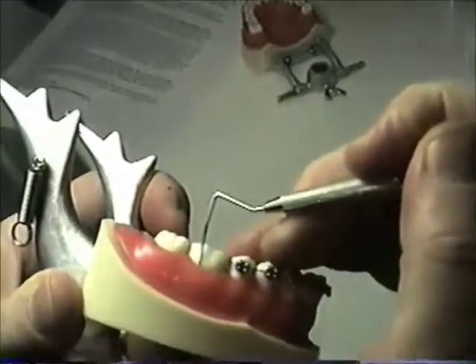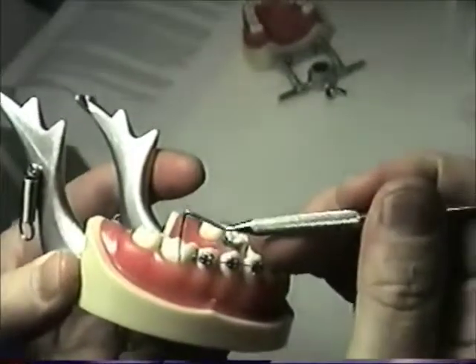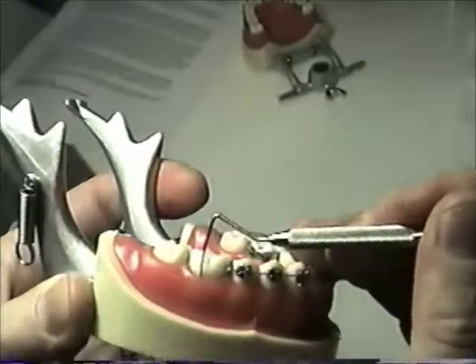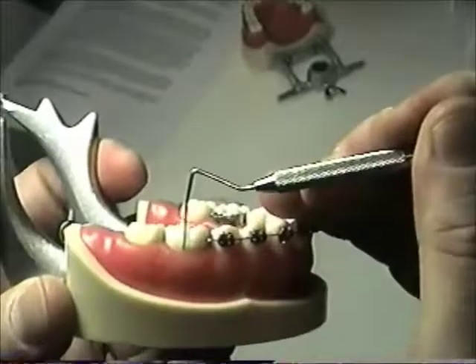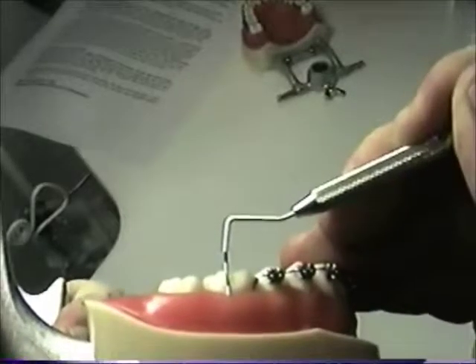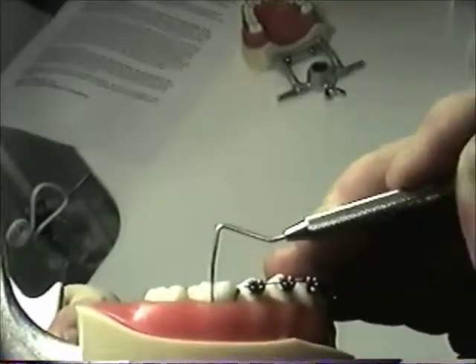Let me show you something. All around your teeth, this probe, and they do this at your dentist office, after they clean your teeth, they should be going around with this probe, and they can sink it in, and I don't know if you can see the mark there. I'll turn this so you can see it.